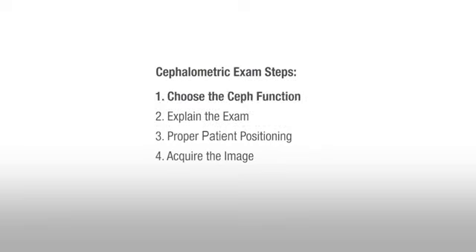First, choose the appropriate Ceph functions. Second, explain the exam to the patient. Third, properly position the patient. And last, acquire the image.